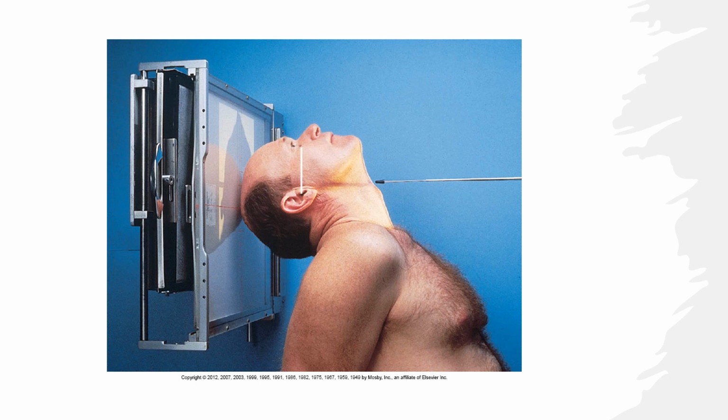Remember the third rule of trauma? When you can't get proper alignment between the body part and the image receptor, maintain the proper relationship between the central ray and the anatomy. Sacrifice the relationship of the anatomy to the image receptor.